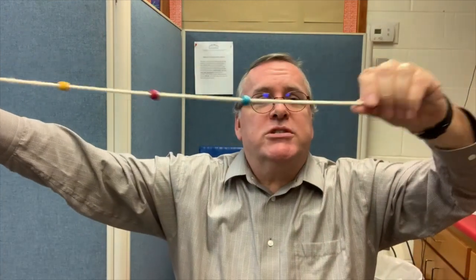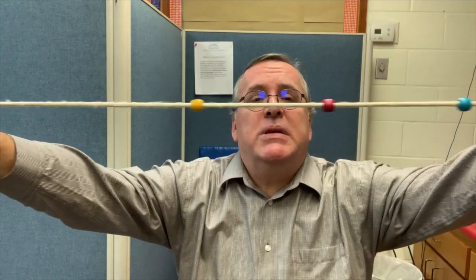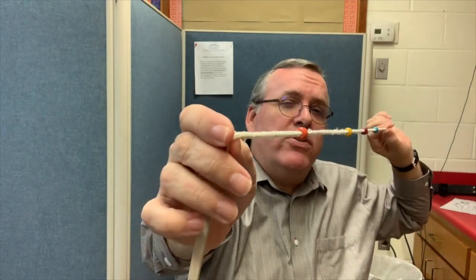A Brock string is pretty simple — you're going to make this in your clinic. We're going to use some beads; these beads are about a centimeter in diameter. The piece of string is about 24 to 30 inches long. You want it to be long enough so the child can see the furthest bead away clearly and appropriately.